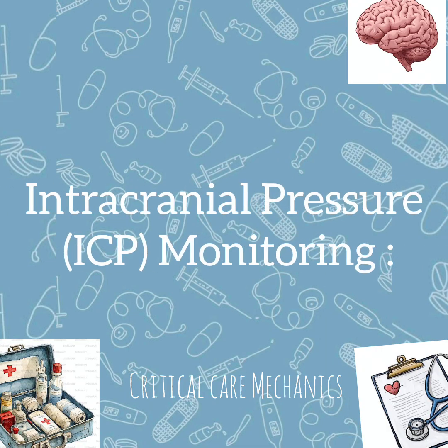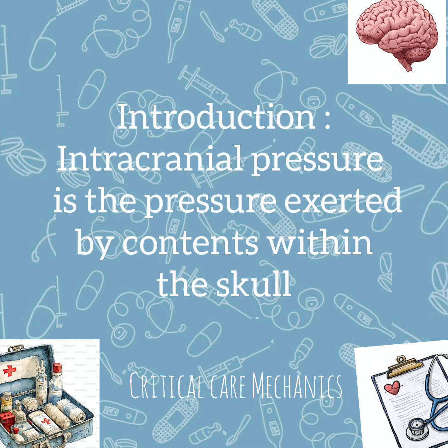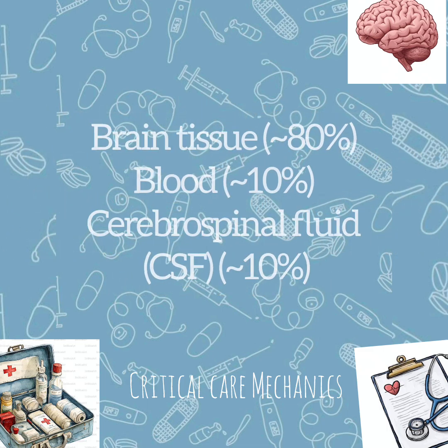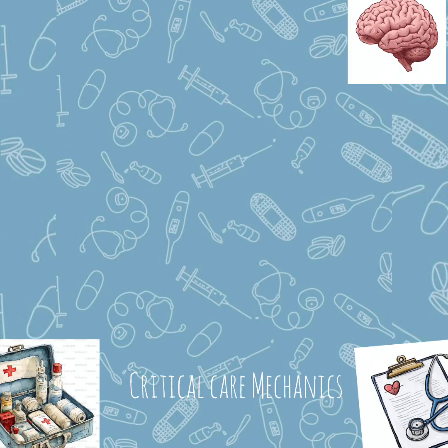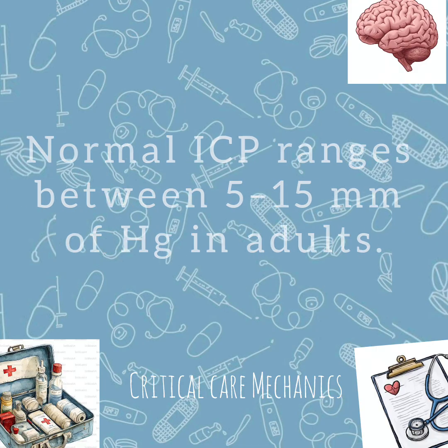Intracranial pressure (ICP) monitoring. Introduction. Intracranial pressure (ICP) is the pressure exerted by contents within the skull, which include brain tissue approximately 80%, blood approximately 10%, cerebrospinal fluid (CSF) approximately 10%. Normal ICP ranges between 5 to 15 mm of mercury in adults.